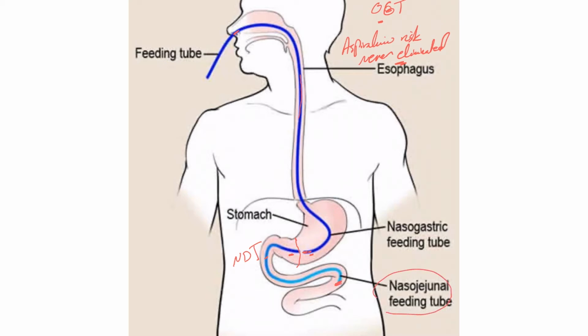Of course, the risk of aspiration here is the least, and it's less in nasoduodenal, and it's more in nasogastric tube, pre-pylorus more than post-pylorus. I cannot recall when was the last time we used nasoduodenal or jejunal tube. We mainly use nasogastric tube or orogastric tubes. Just quickly, the nasoduodenal or nasojejunal is mainly used if you have problem gastric motility or chronic vomiting or very high risk of aspiration. But in ICU, 99% of the time you will be encountering either nasogastric or orogastric tube.